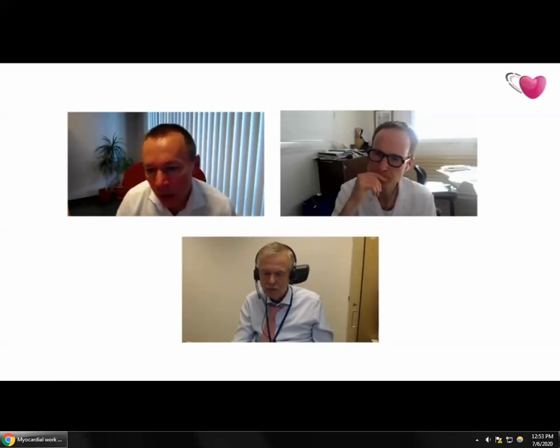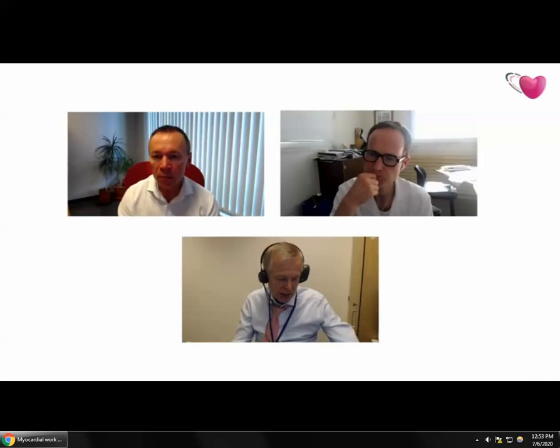Martin? I think it's not faster, but it helps mostly in the situation when there's a difference in the blood pressure. I don't think it's faster. So in fact, if you have a patient who for some reason is nervous and has a high blood pressure, which will take down the strain, the work might be okay. So it might give you a better image or understanding of the state of the heart, because you incorporate the blood pressure in the measure.